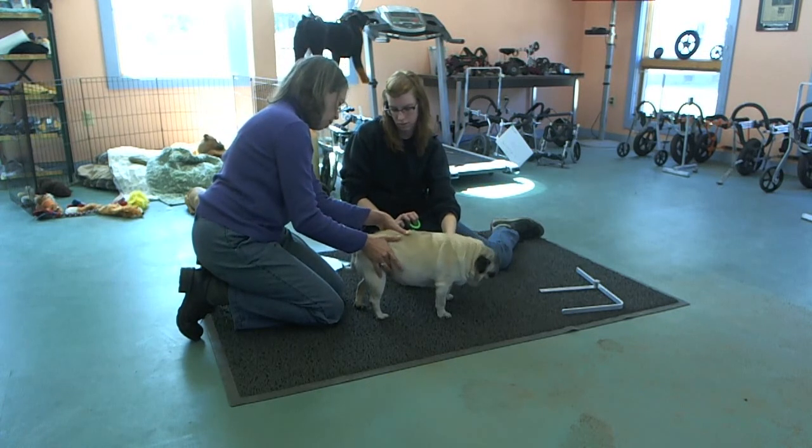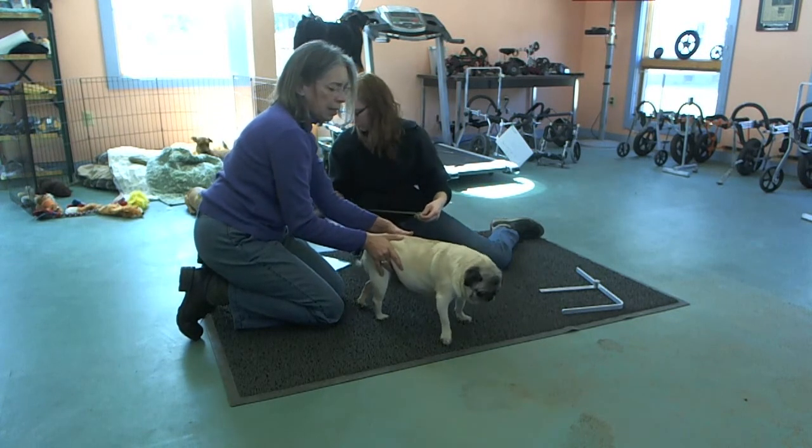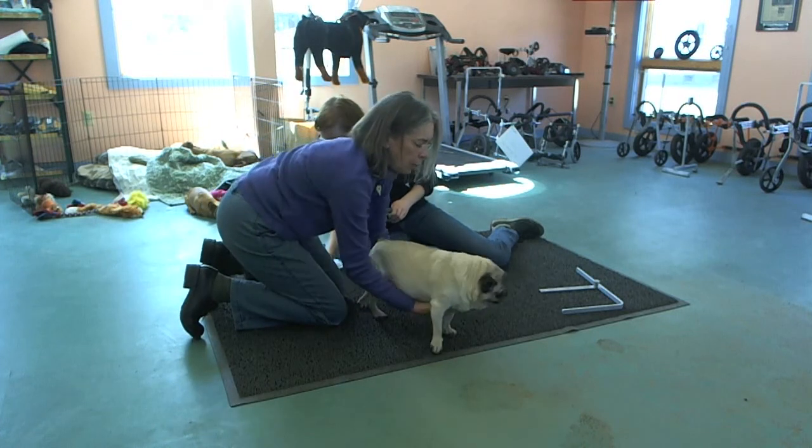Make sure the dog's body is straight. They have a tendency to curve — that's what she's doing right now.